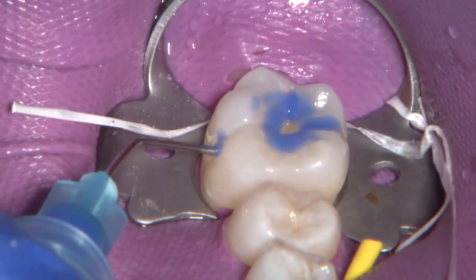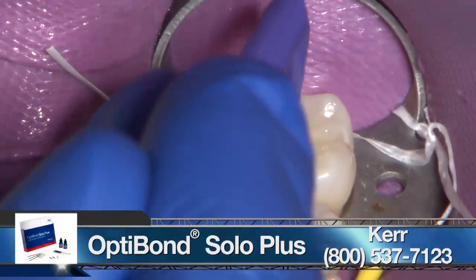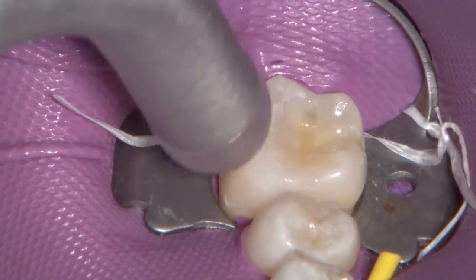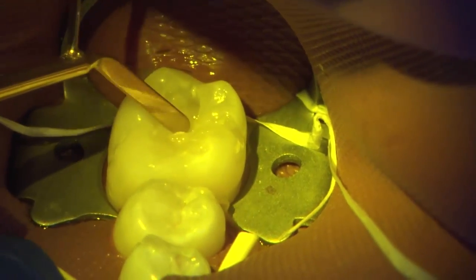The cavity is acid-etched with 37% phosphoric acid to first etch the enamel, then the dentin. After rinsing and carefully drying the cavity, OptiBond Solo Plus from Kerr was used for direct bonding application of the material of choice: universal Camouflage composite. Because Class 1 restoration comes with an increased C-factor, the developing curing contraction stress of bonded surfaces can increase too. To control shrinkage and decrease the C-factor, the cavity receives small composite increments. With proper lighting and the ability of Camouflage composite to be placed in small 2 mm increments, the effect on clinical success can be improved.